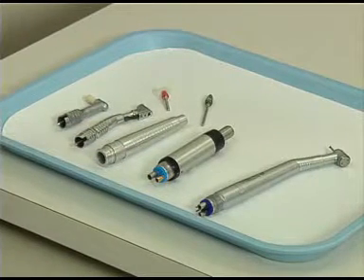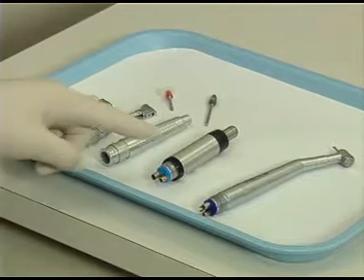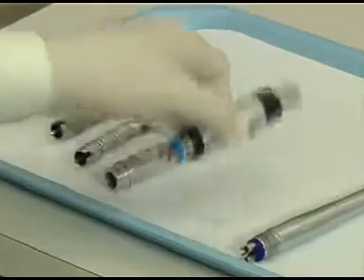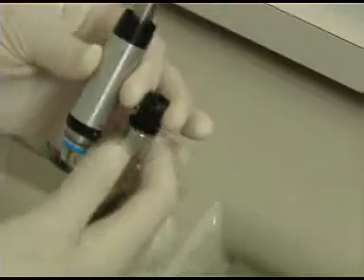To begin, identify the low-speed handpiece motor base and then attach it to the dental unit. Make sure that the receptors are aligned properly and make sure that they are screwed on tight.